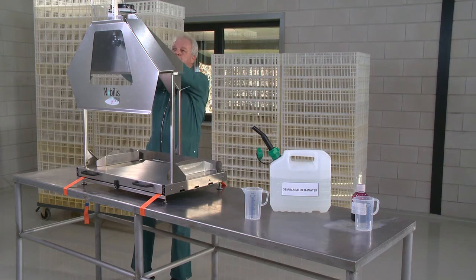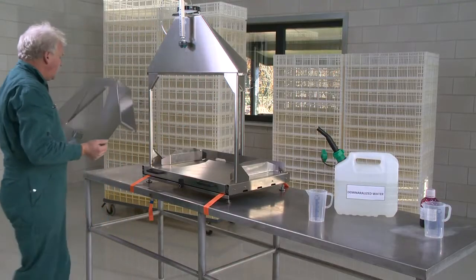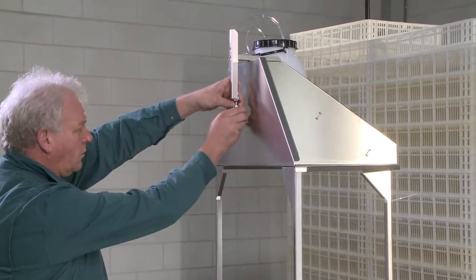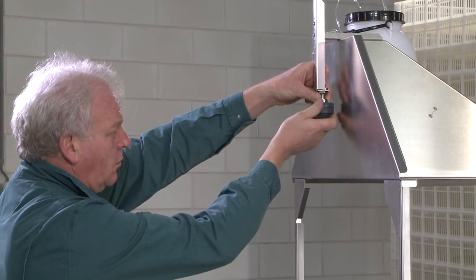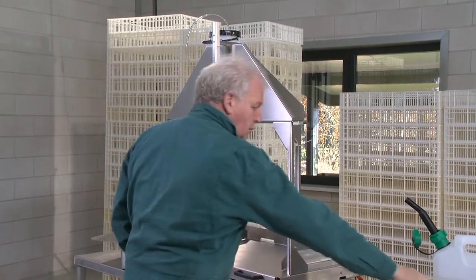Once the Nobilis Spray has been assembled correctly and the vaccine reservoir is filled, it is necessary to pump 10 to 15 times until liquid comes out of the spray nozzle. When the device is primed for the first time, it is advised to remove the nozzle and to flush the tubes without the nozzle. This ensures that coarse particles are rinsed out of the tubing system and cannot block the spray inlet of the nozzle.